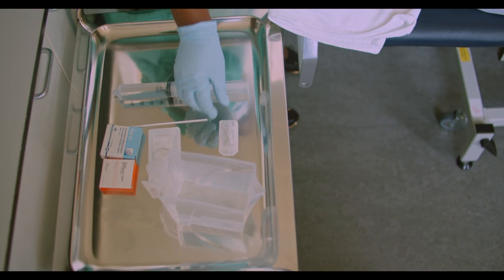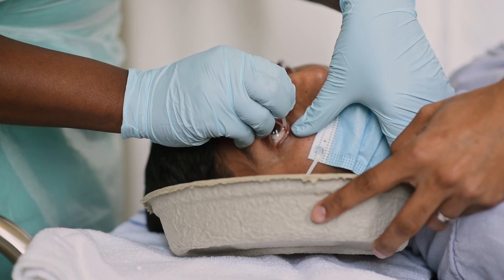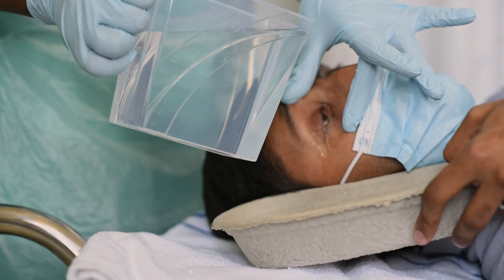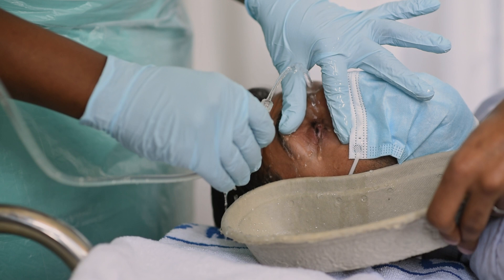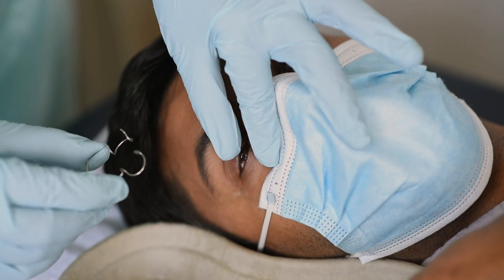Put local anaesthetic drops into the eye and remove any contact lenses. Use your fingers to open the eye and pour fluid from a close distance using a jug or giving set. You can also keep the eye open with a speculum and use a large syringe to irrigate.